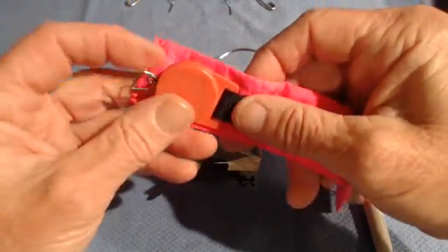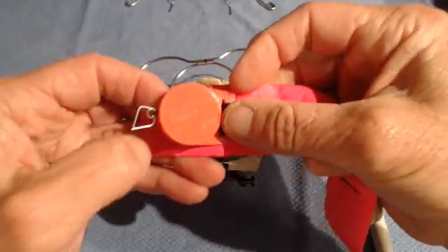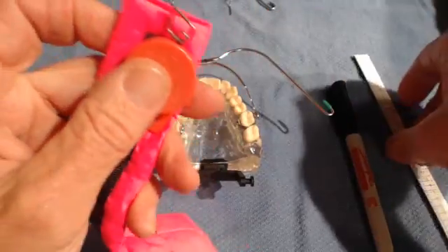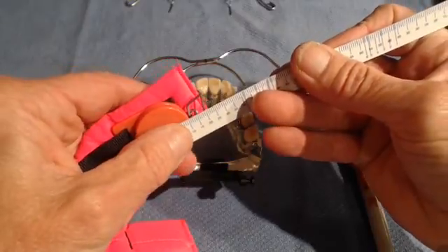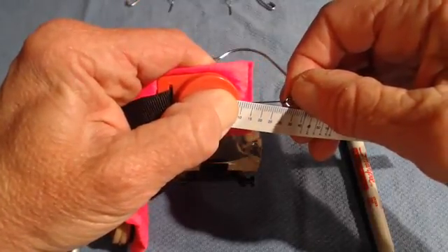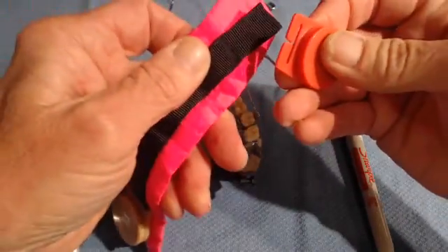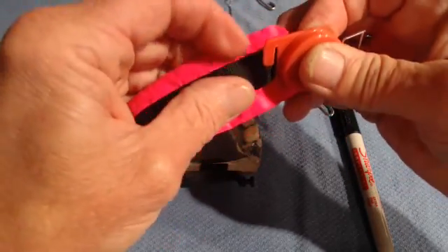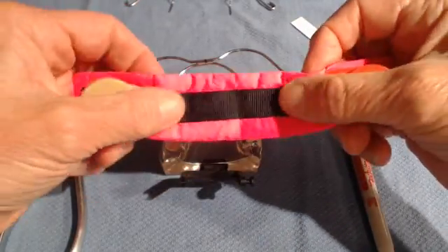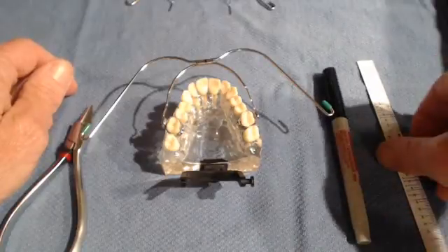The neck strap — this is an older pink version; the new ones are black — can go on in this position or that position based on the size of the patient. As long as you have anything past a 20-millimeter pull, it will deliver the stated force. For instance, if you put the ruler at 10, then 10 plus 20 is 30, so anything past that 30-millimeter mark delivers the advertised force — just about an inch. The force module hooks onto multiple spots; our new neck straps only have two options, while older ones had many options.